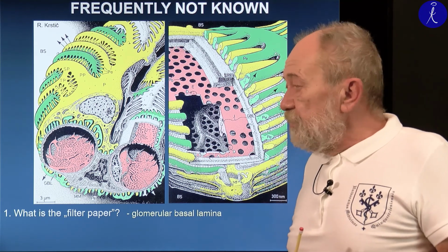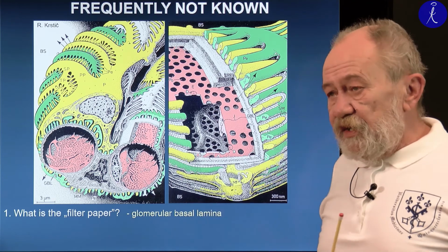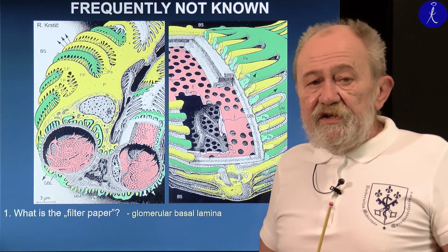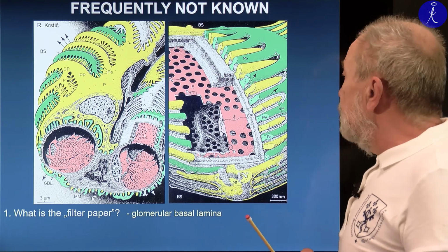As you know, by making coffee for yourself and filtering through a paper time after time, the filter should be thrown away. So here in the kidney also, the filter paper should be replaced, because molecules stuck in it, and finally nothing could penetrate through.